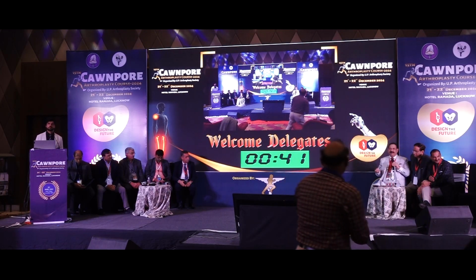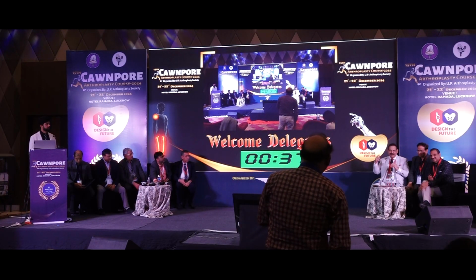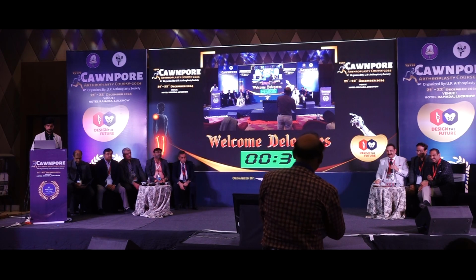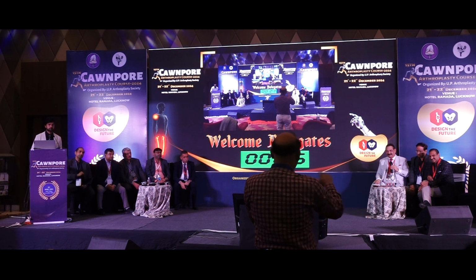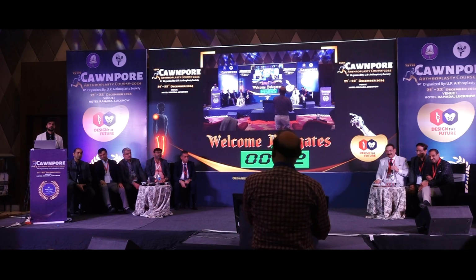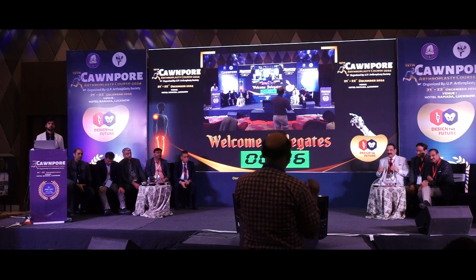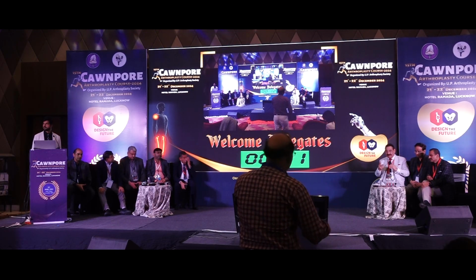We have learned a lot in our country. Traction usually helps. But sir, whenever there is strong fibrosis, traction will not help. What I did in this case, first I released all the soft tissue, all the fibrosis inside the joint, and then applied the traction. The traction is applied below the knee, in the tibia, not in the femur. The femur is the same compartment. Sometimes there is a chance of infection when you apply a cemented or uncemented stem.